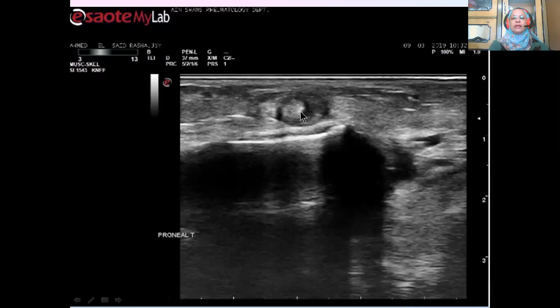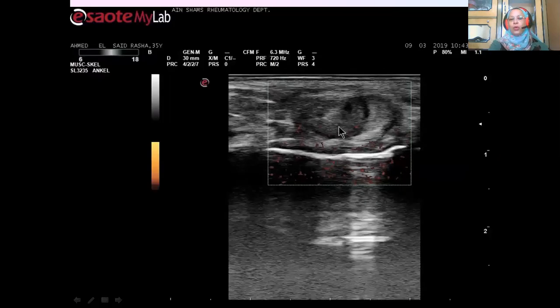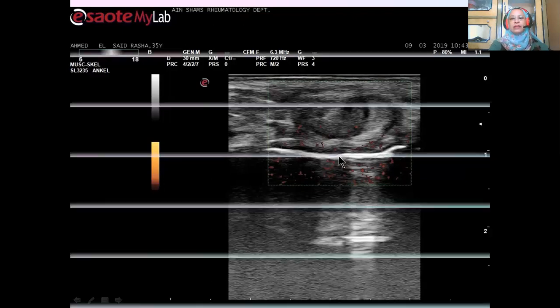Above it, the short axis of peroneal tendon, again, split tear in peroneus brevis with herniation of peroneus longus in between. This is a magnified image with split tear and herniation of peroneal tendon and extension of completely normal hyperechoic fibrillar structure of calcaneofibular ligament. Lower, the peroneus longus tendon started to appear flattened, heterogeneous, hypoechoic with positive Doppler signal, which indicates occurrence of tendinosis of peroneus longus tendon. This is the magnified structure.